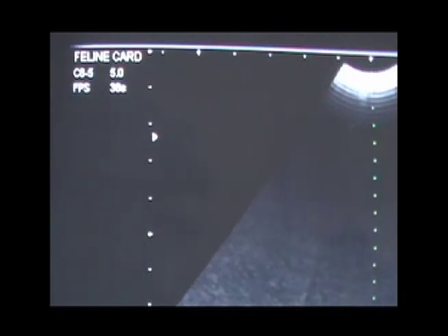Focal points are used to improve image quality at certain areas of the ultrasound screen. Some ultrasound machines require the operator to set and place the number of focal points desired for every image. The operator should constantly adjust the focal point or points to the area of interest on the ultrasound screen. The operator must also choose the number of focal points to use. Some ultrasound machines offer from 4 to as many as 12 focal points.